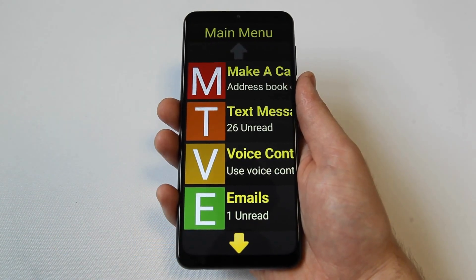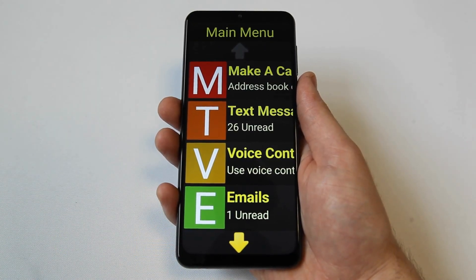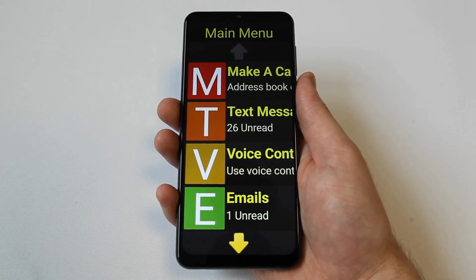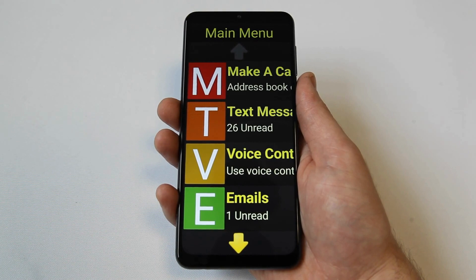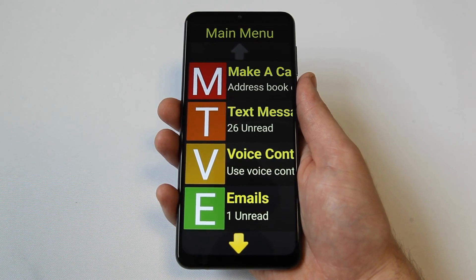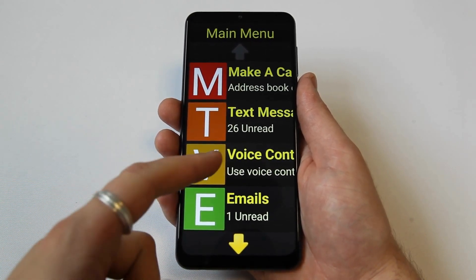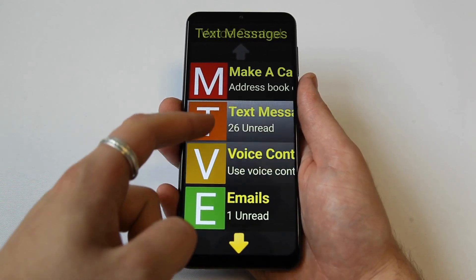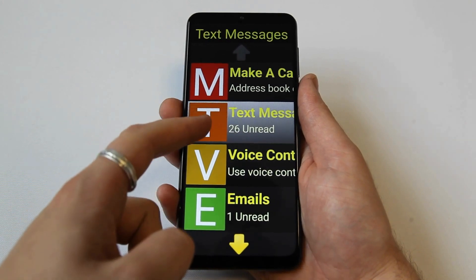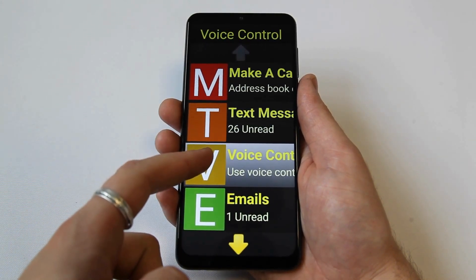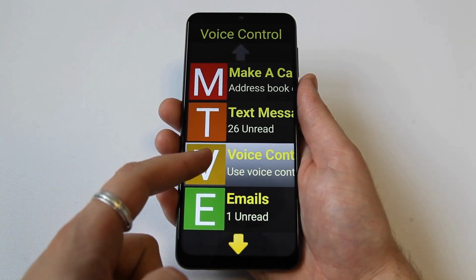Voice control can be accessed from the first main menu screen and is the third option down. Simply select voice control by pressing it, or move your finger up or down the screen until you hear the voice control menu announced and release.